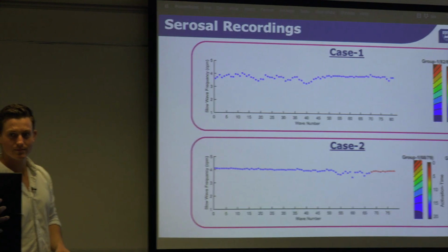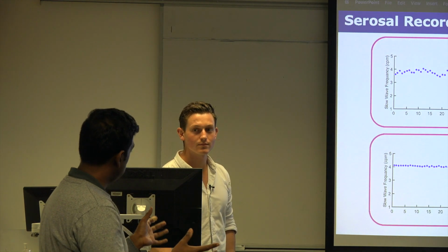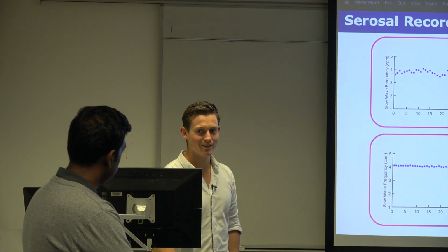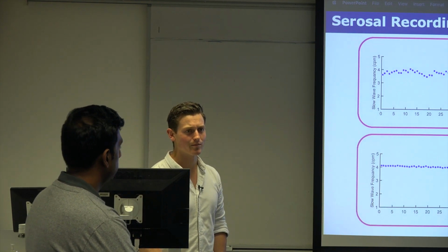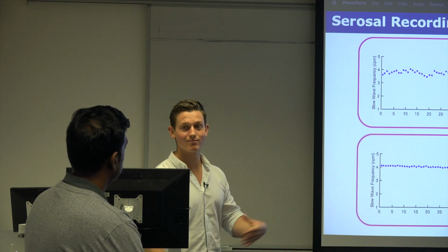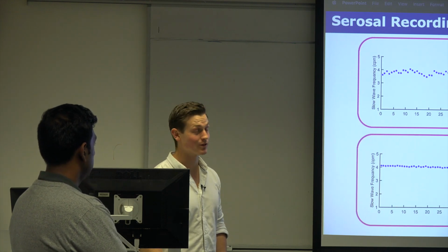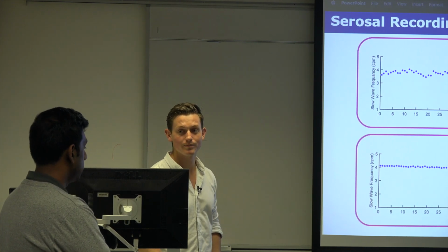One question about your biodiversity. You had 4 different subjects. Were the stomachs distended or were they empty? Because that may have an influence on the size. They all should have been empty. This is data I think recorded from 2005, much before my time, so I can't attest to the validity of that, but they were reported as empty. But you're right, that would make a big difference, and those stomachs were so vastly different that we did consider that as well.